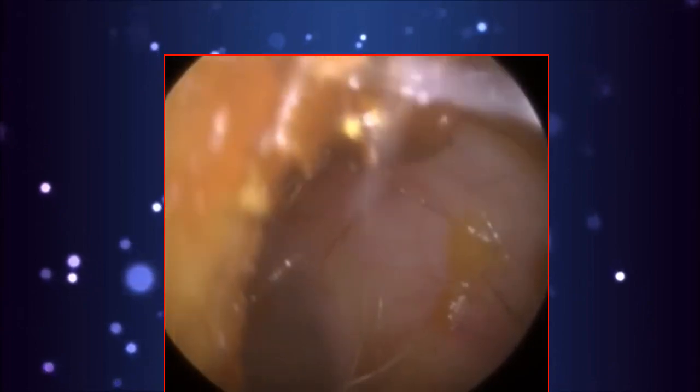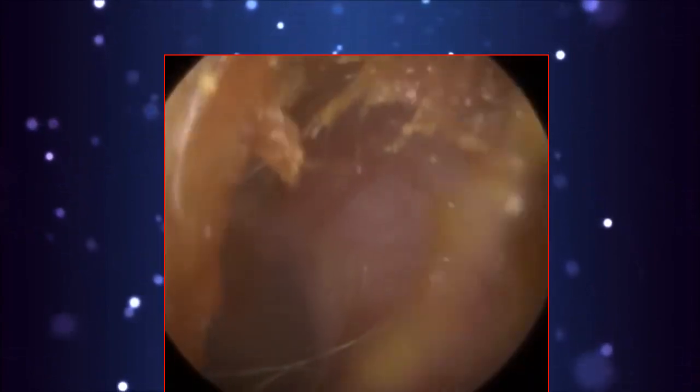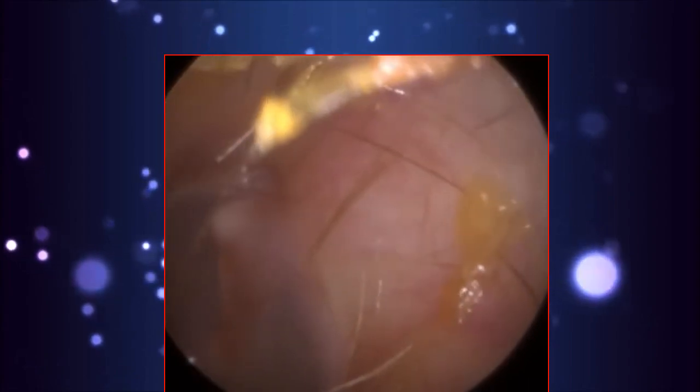You can see the patient's got a bit of matted hair there. So this plug came out in, I think it came out in 2 pieces, or was it in 1? Let's have a look. No, so I've got the main bolt there. So on the periphery, some sticky wax. Now the patient's hearing's restored. Removing this per se is not going to improve their hearing, but it's on the lateral part, so I'm just gently using the suction probe to release the sticky wax off the canal wall.